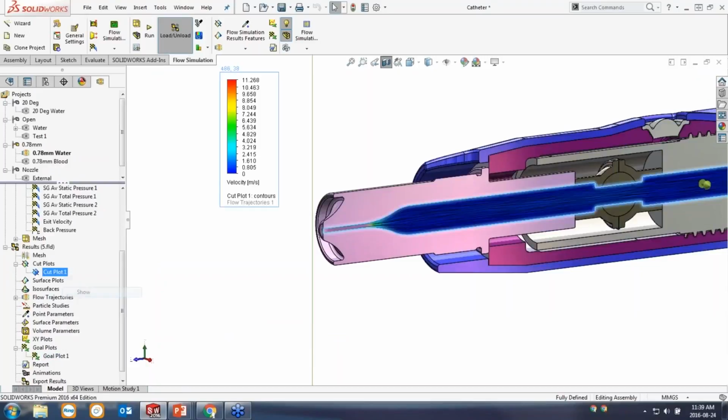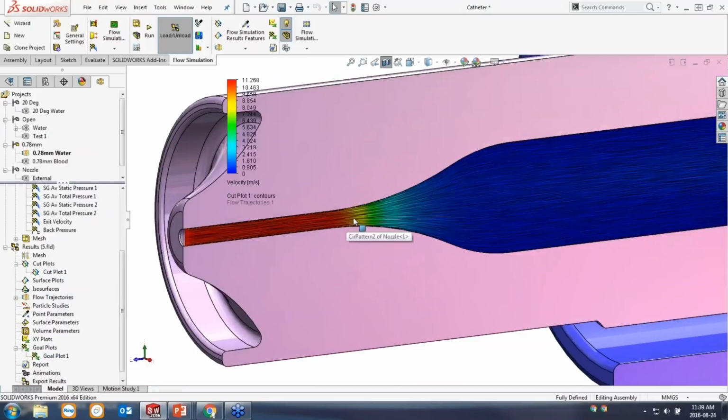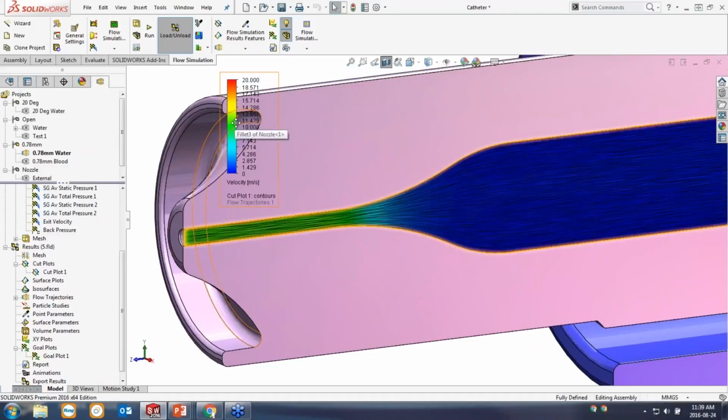If I take a look at a cut plot for this one here, we can see that again. Of course, we've got our fastest fluid flow at the nozzle tip, but much less than 20 meters per second. If I go and crank that maximum up, we can see we're not even halfway along the scale. We're looking great.